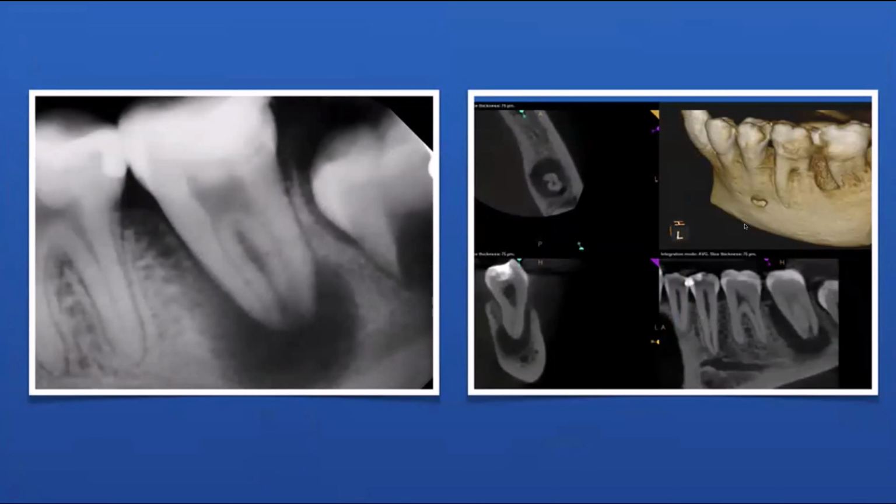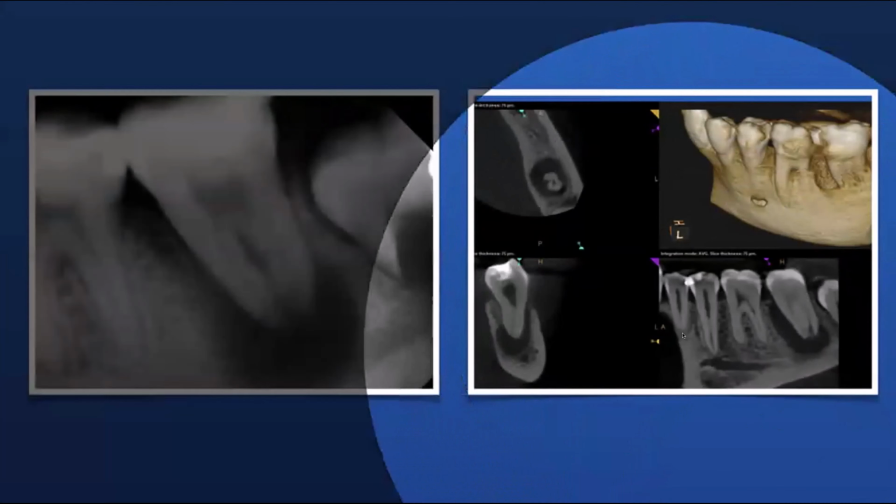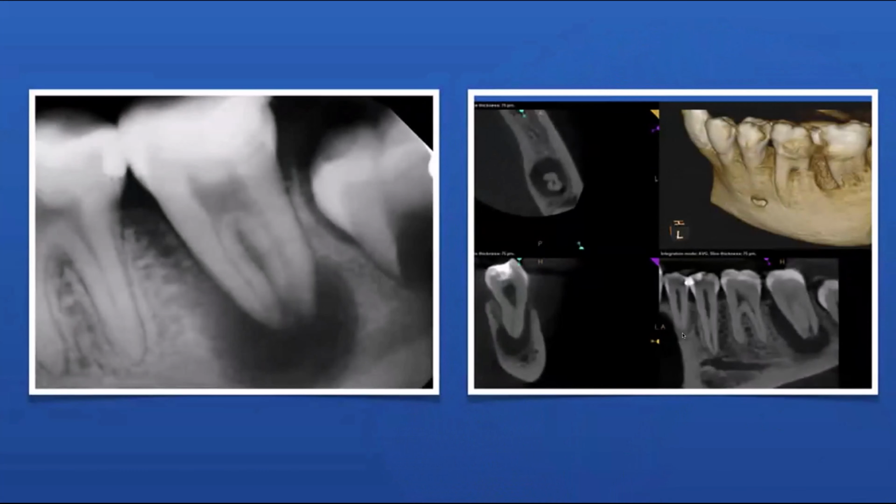This patient presented with a lower second molar, a huge radiolucent finding. You can see on the CBCT, apical and vertical defect here. The tooth was moving, plus two mobility. I did this case in one visit.